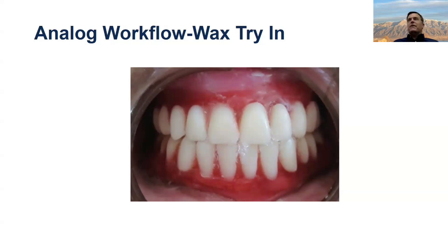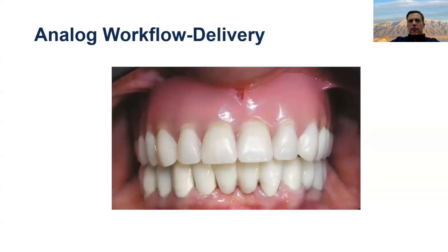Does it fit like 90% of what you want, and it'll probably get picked up and improved a little bit in processing? Or is it maybe 65% of what you want, and you should probably do a reline inside to make sure that you have the correct tissue shape? If you're not sure, it's better to take a reline impression inside the base plate at the try-in stage. So after the wax up, your laboratory will make any changes necessary to the setup, then process the denture.